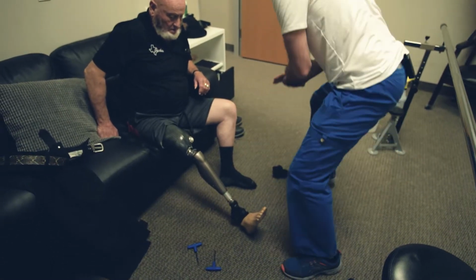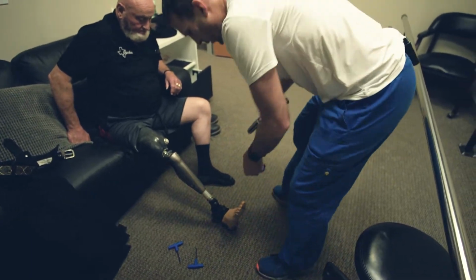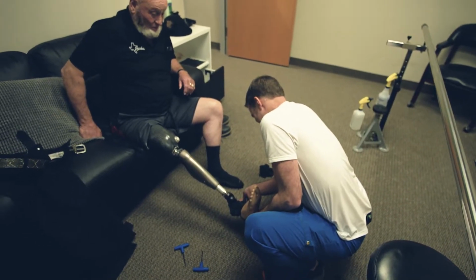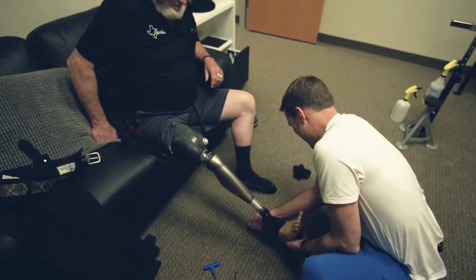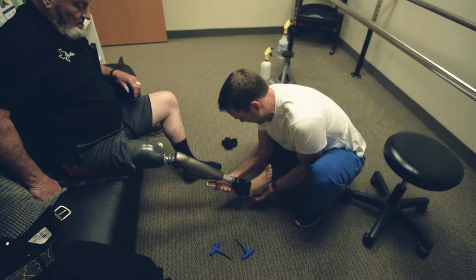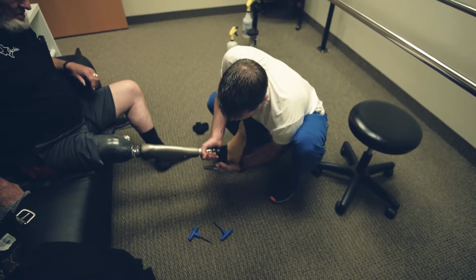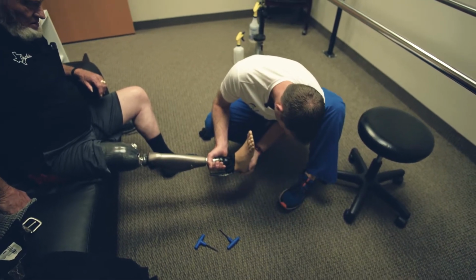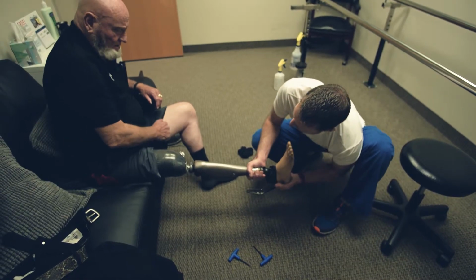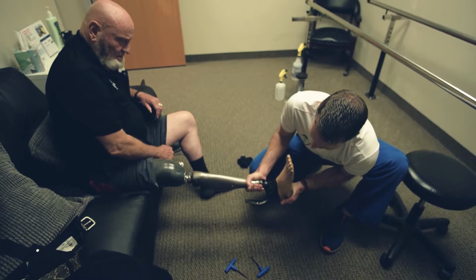Okay, so do you have a shoehorn at home? I don't know. All right. We'll figure it out. It's not hard to get these off, but do you think you could do that? Sure. This one's going to be easy to get on because it's broken. But when I get a new one, it might be tighter. It's going to be a little tighter. So if you look, I can find a shoehorn. Let me show you how this works because I think that'll make sense.